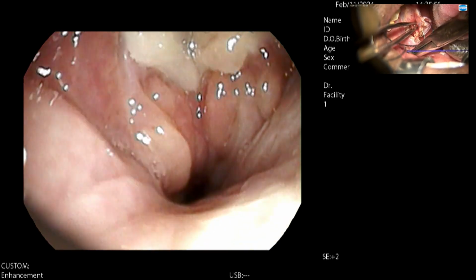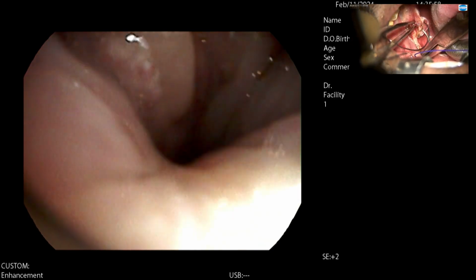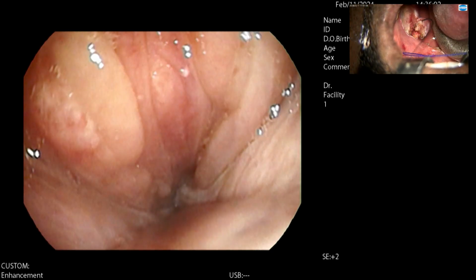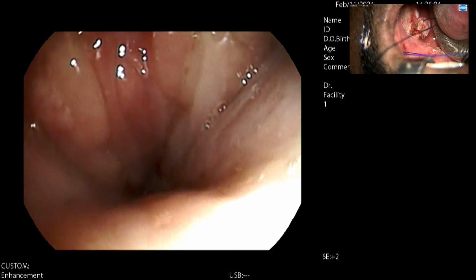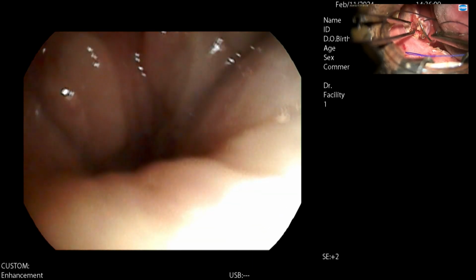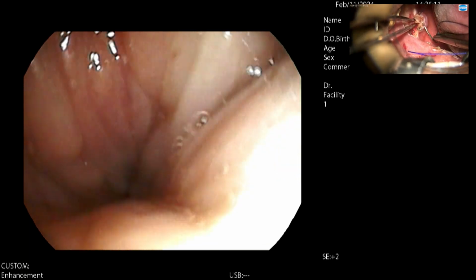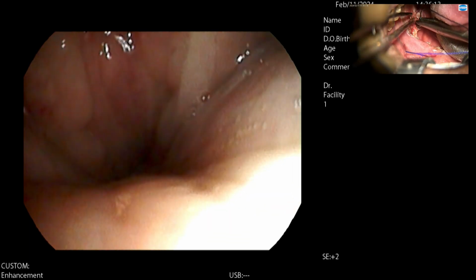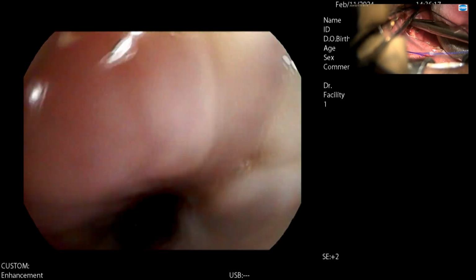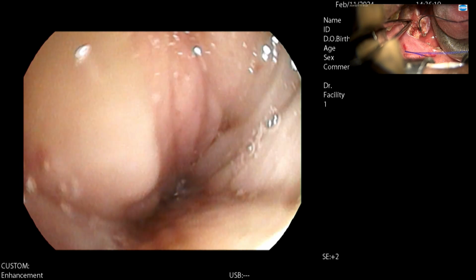And now we are going to show you the velopharyngeal collapse. This is the lower velopharyngeal collapse. It's a complete collapse. We are using a Pentax endoscopy system and BIS monitoring also. I'll show the BIS monitoring, and the person will talk about it shortly, to tell the depth of the sleep and the level of anesthesia.